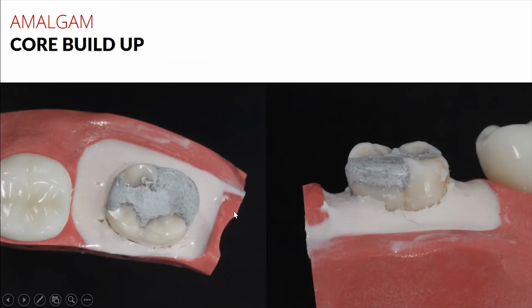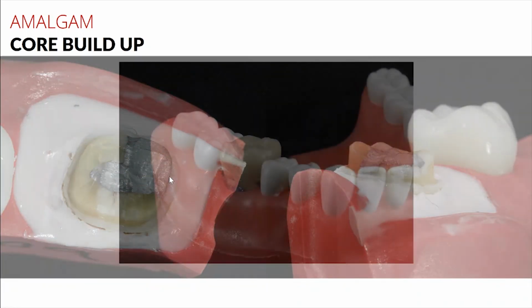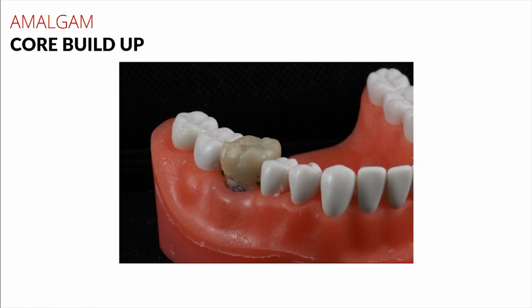Okay, so once you build it up, of course this is going to need a crown for cuspal protection. You can see how much of that tooth structure is lost. So you end up doing your crown prep, and then you can seat a crown on top of it. Okay, so that's the concept of core buildups. In our case, we're going to have you do specifically an amalgam, a chamber retained amalgam core buildup in your simulation clinic.